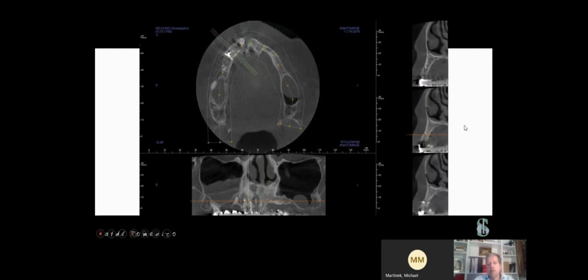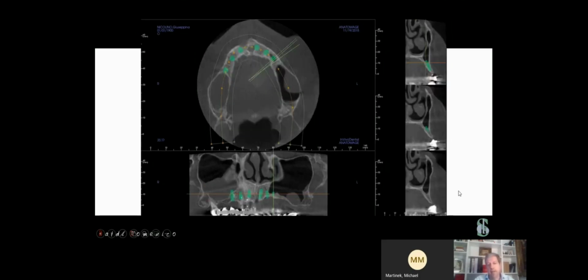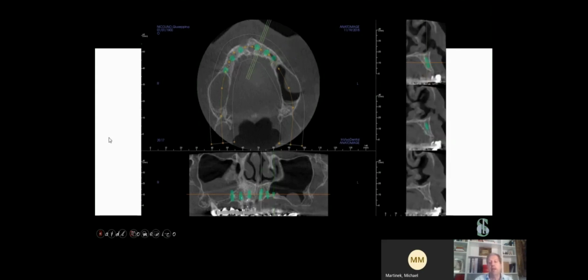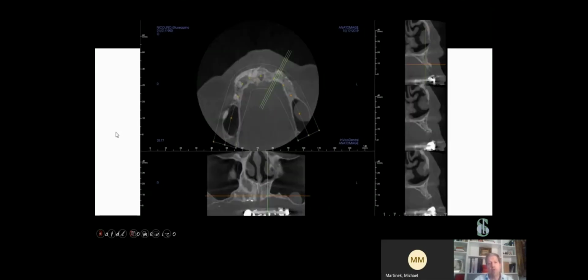So you can understand that in order to avoid disaster, first of all, we need to make an atraumatic extraction of the root. At the same time, it's necessary to have a healing of this sinusitis. But we can plan our implant surgery in order to decide where we have to work with great attention, where we have to prevent the resorption of the bone, because we know that there we would like to place our implant. And so we have to understand where we want to maintain the quantity of the bone and where it is necessary to have an augmentation of the quantity of the bone.